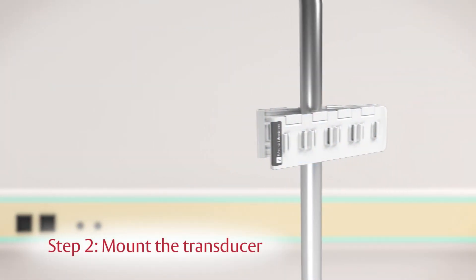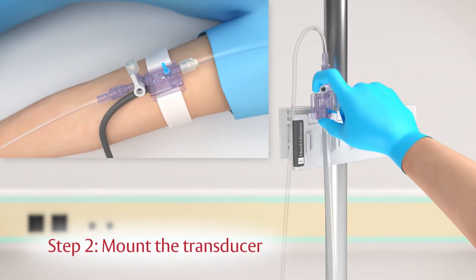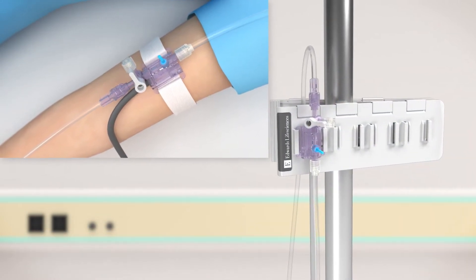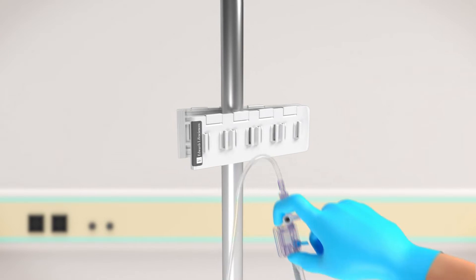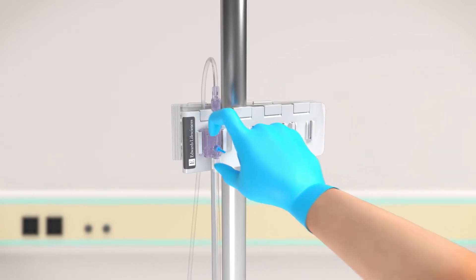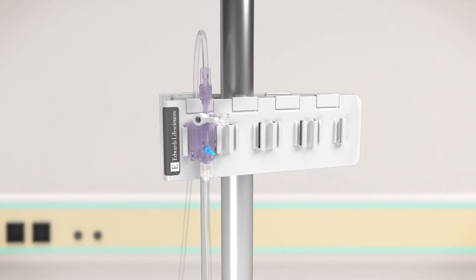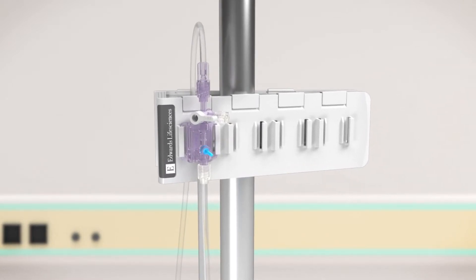Step two: TruWave transducers can be mounted on either an IV pole or on the patient's arm — the setup procedure is the same. This video demonstrates the pole-mounted method. Insert the TruWave transducer into a mounting backplate that is secured on an IV pole.